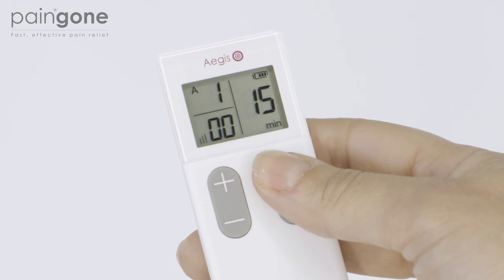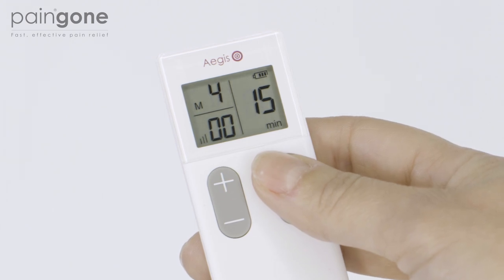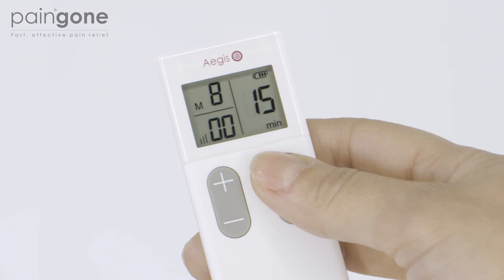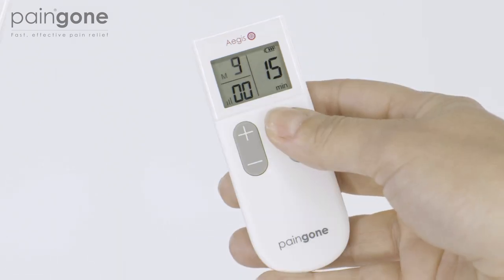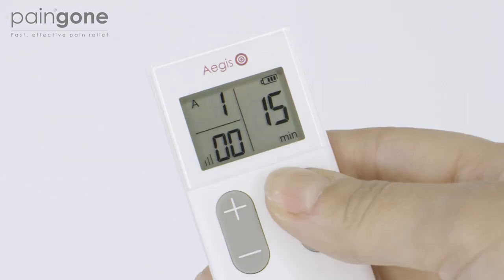Press and hold down the F button to switch to manual mode. In this setting you can choose a single fixed type of stimulation. There are 9 options available. Tap F to cycle through the different options. To return to combination pulses, press and hold down the F button once more.